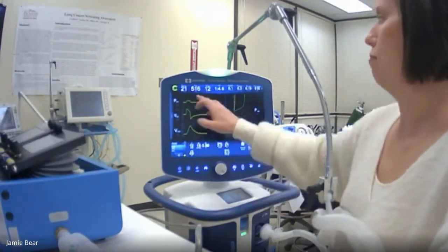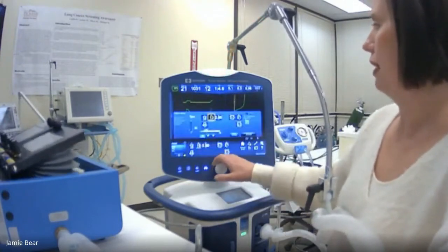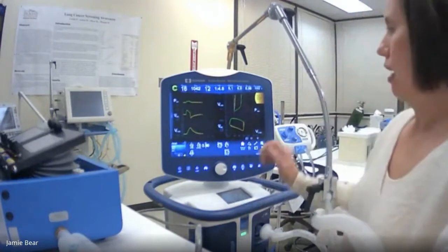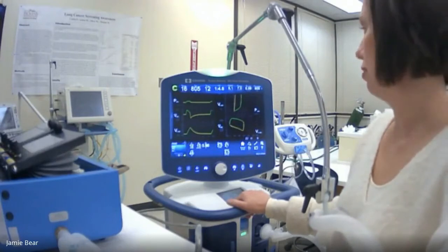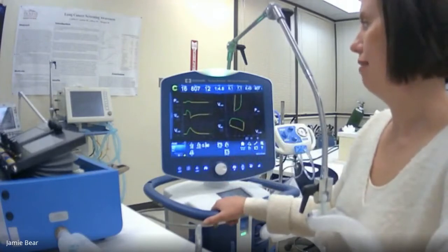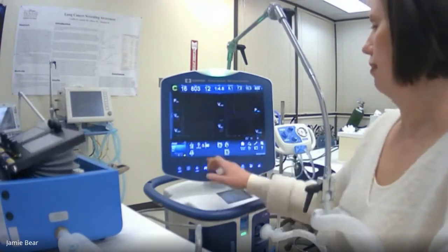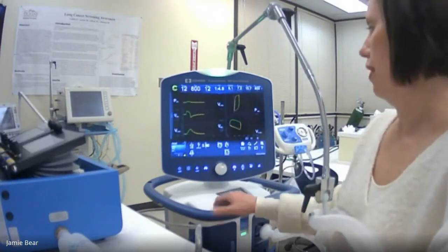Okay, we're still monitoring. Oh boy, we got 1,031. So we need to definitely get the peak inspiratory pressure down, because our tidal volume that we were getting was very high, closer to about 15 mils per kilo. So we don't want to do that. Okay, we're still getting about 807, so that's still too high. So once again, very compliant lungs. So 7 over 5, we'll see a peak of 12. Excuse me, I'm sorry. Yeah, our peak of 12.